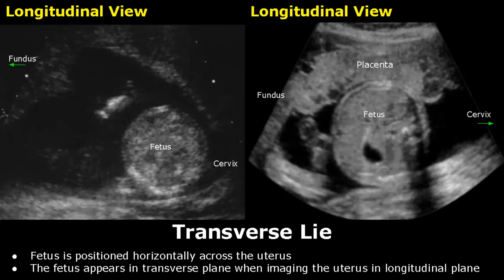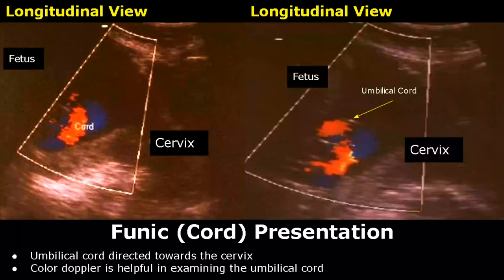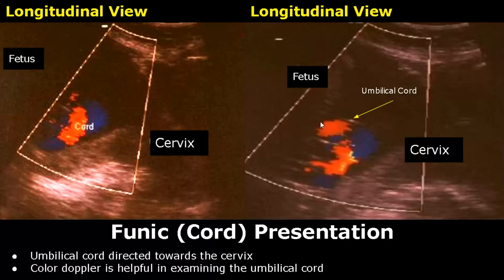In a funic or cord presentation, the umbilical cord is found right next to the cervix. Color Doppler is very helpful in locating the umbilical cord.